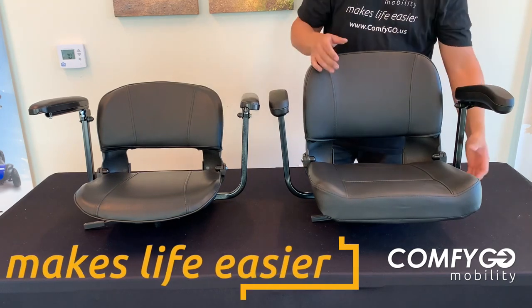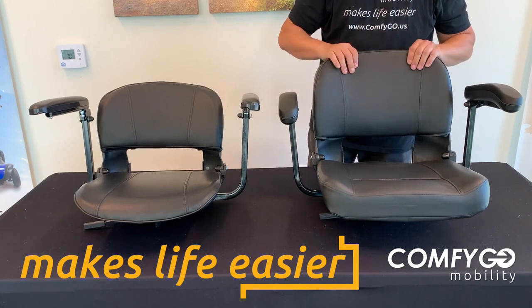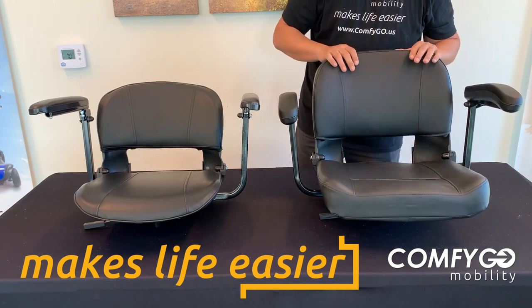Here's our super seat. Now check it out — a little bit more padding, but it's a little more heavy as well. So you might like this seat here, but it is an upgrade option on our Z4 scooter.